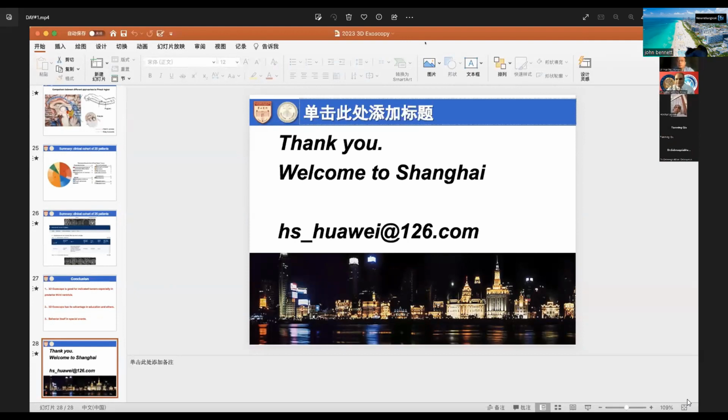Nice talk. How do you decide whether you will go posterior interhemispheric approach or supracerebellar approach for a pineal region tumor? Is there any way you decide pre-operatively which approach you will select? Yes, thank you. This is a very important question. This is also something we discussed a lot in our papers.